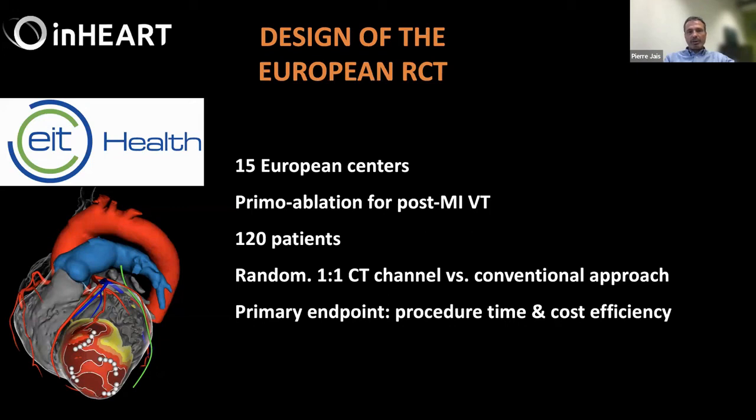So we limited ourselves to 120 patients as a target, half being randomized to the conventional approach of one of the 15 European centers participating, and it can be different among centers. And the other half, another 60 patients, randomized to the CT channel approach I just described.